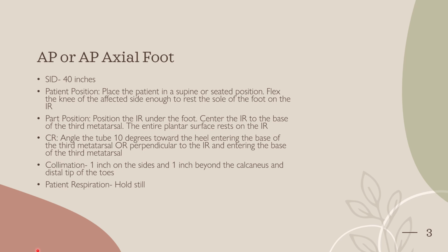Okay, our first projection is the AP or AP axial foot. The SID will be 40 inches. The patient position: place the patient in a supine or seated position. Flex the knee of the affected side enough to rest the sole of the foot on the IR. The part position: position the IR under the foot. Center the IR to the base of the third metatarsal. The entire plantar surface rests on the IR.